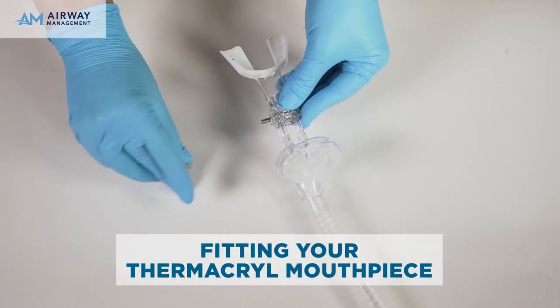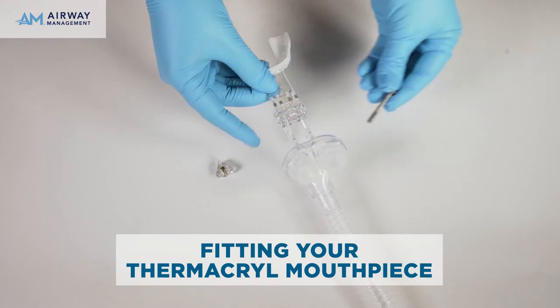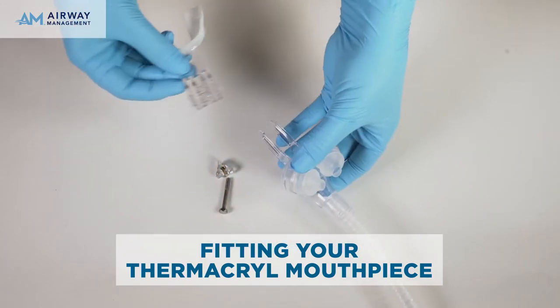Begin by loosening the nut and remove the mouthpiece. Put the nut and bolt in a safe place. Place the mouthpiece in your mouth and bite down gently. You should find that your upper teeth fit within the flat surface of the mouthpiece. If not, you will need to widen or narrow the mouthpiece after heating.